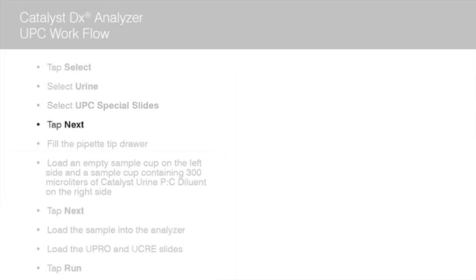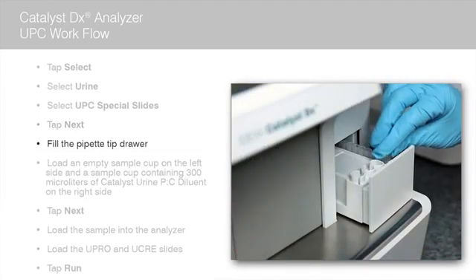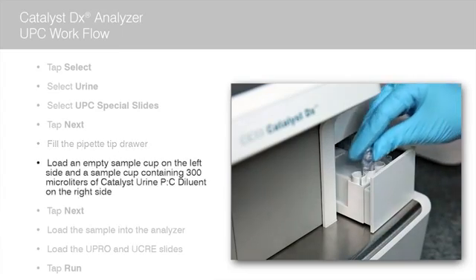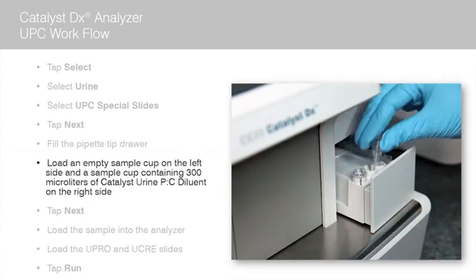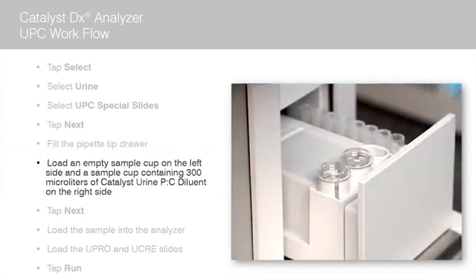The Load Dilutions Materials screen displays. Fill the pipette tip drawer. In the tip and diluent drawer, load an empty sample cup on the left side and a sample cup containing 300 µL of diluent on the right side. The sample cup should fit into the holders easily.